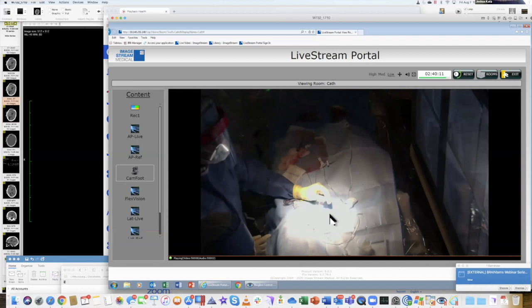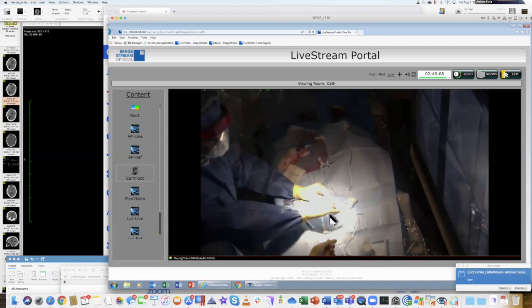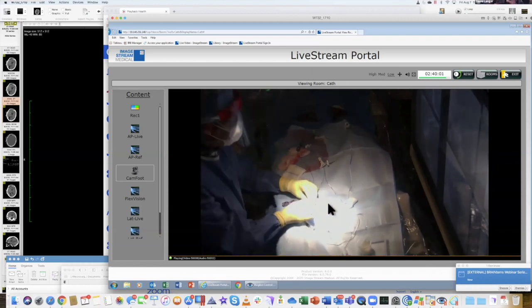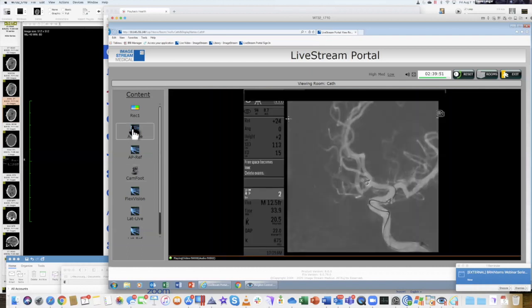I know you've probably talked about this before, but someone was wondering, when wouldn't you be able to use this technique? If the aneurysm neck is too wide or it incorporates the origin of some of the arteries, the coils either come out too easily or they can block the entry of the normal arteries, and that can cause a stroke. So when you have a wide necked aneurysm or one that incorporates the origins of these vessels, it becomes hard to do. There are devices like stents that we're starting to use that protect the origins of arteries. So the technology is getting better and better every year.